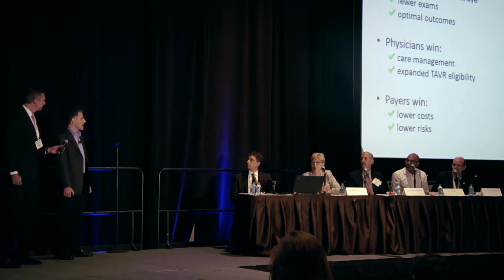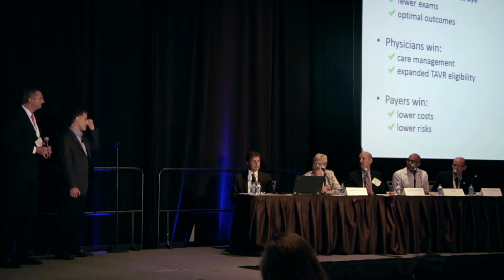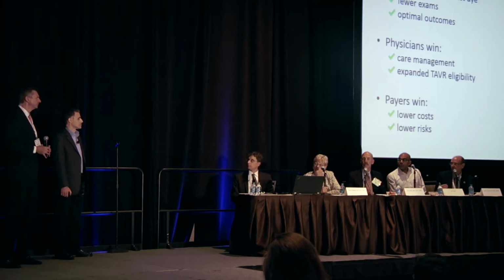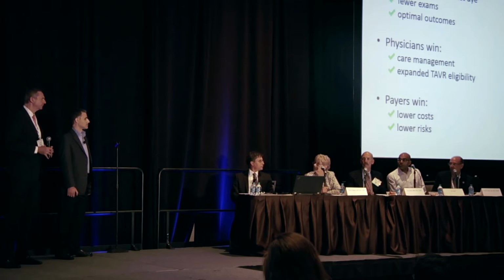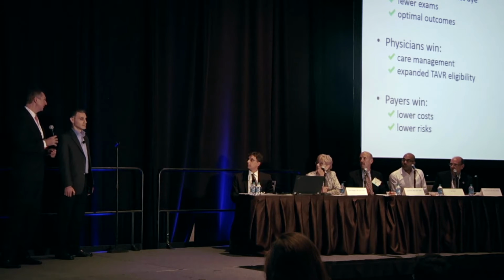We'd also add that as the size of the catheters for the transcatheter valves goes down, the need for peripheral vascular access CT is also likely to be reduced. Well, maybe. You still need to assess it some way. MR, ultrasound, some assessment, even if it's 8 French, because some people don't have that kind of access. So you'll still need some assessment of peripheral vasculature to do the procedure. Yeah, but that could be done without contrast. Yes, I agree.